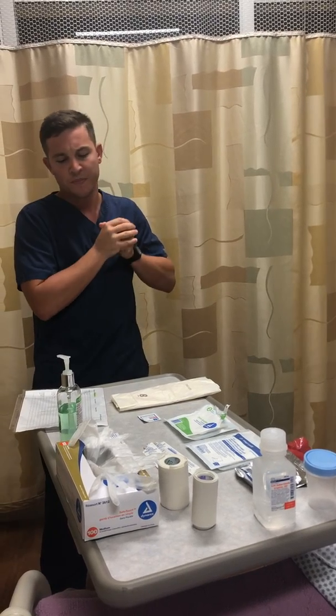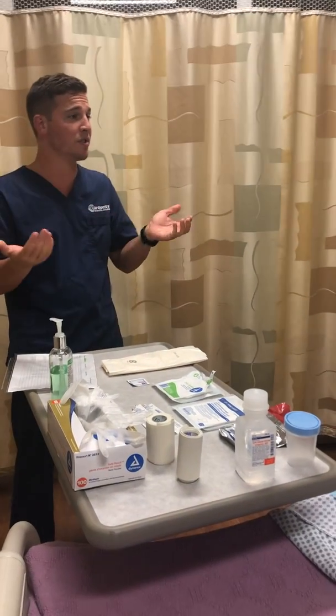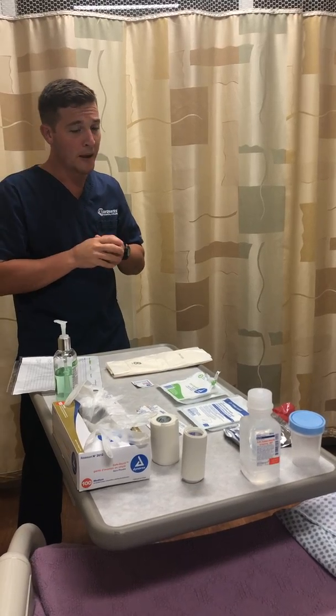Okay, and could you tell me if you have any allergies to anything? She says no. Do you have any tape allergies? She says no. Any allergies to cleansing solutions, maybe normal saline or iodine? She says no. So that's good. You are due, as we discussed earlier, for a dressing change to your chest tube. We gave you that morphine, that'll help out with our dressing change. I'll be checking for adverse reactions after doing that pain assessment, and we charted that.